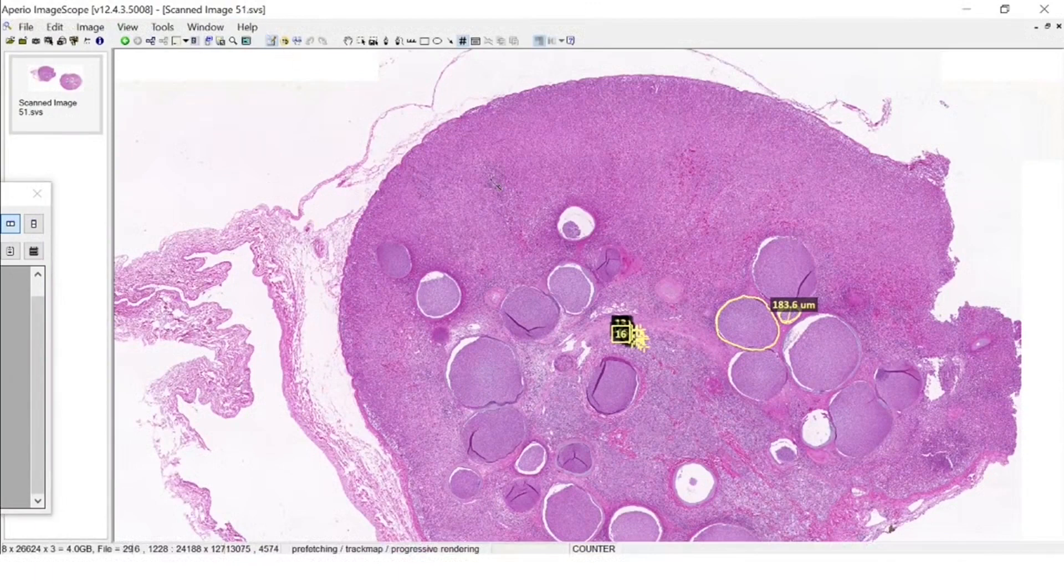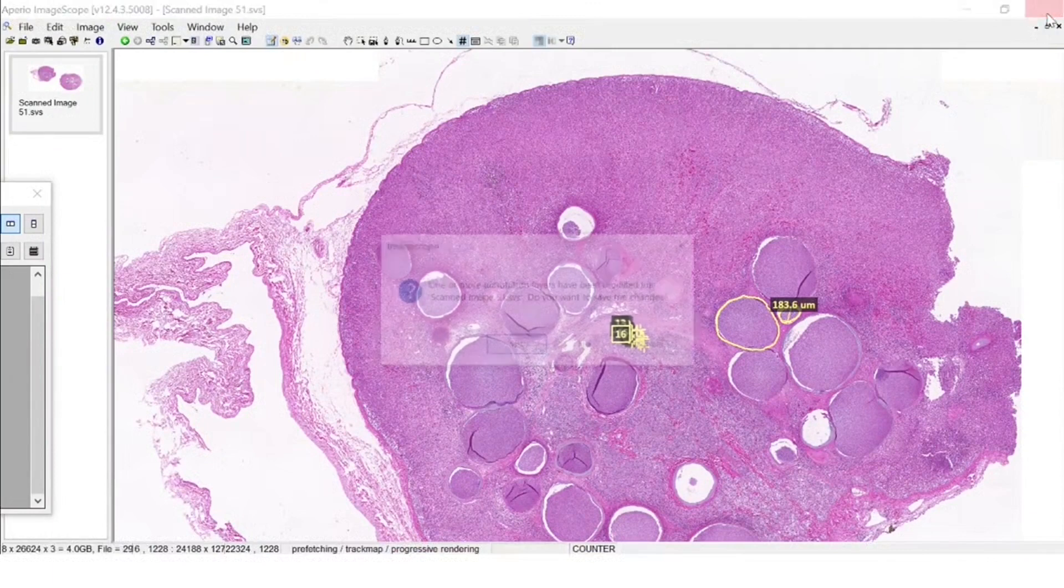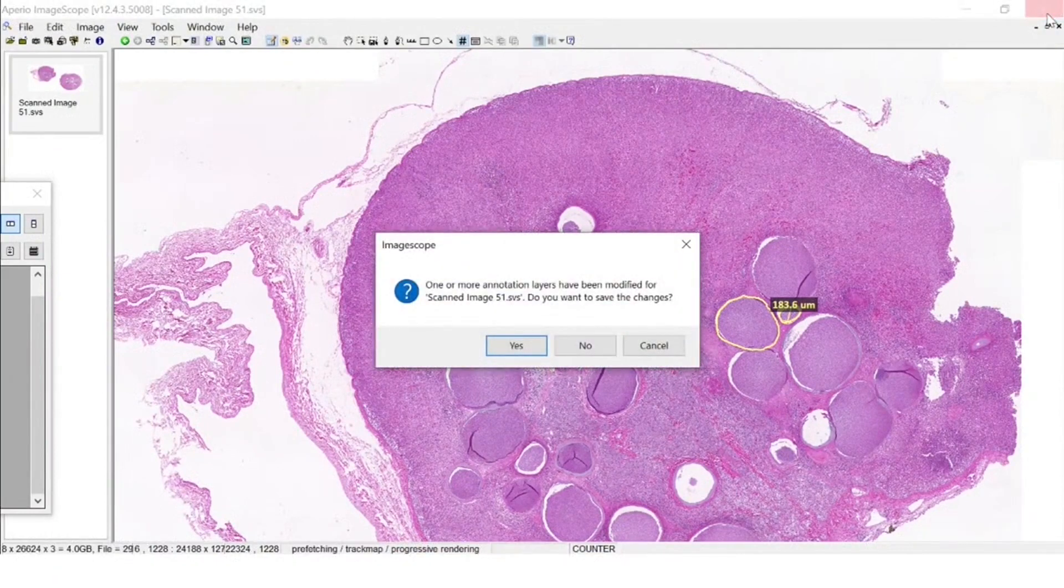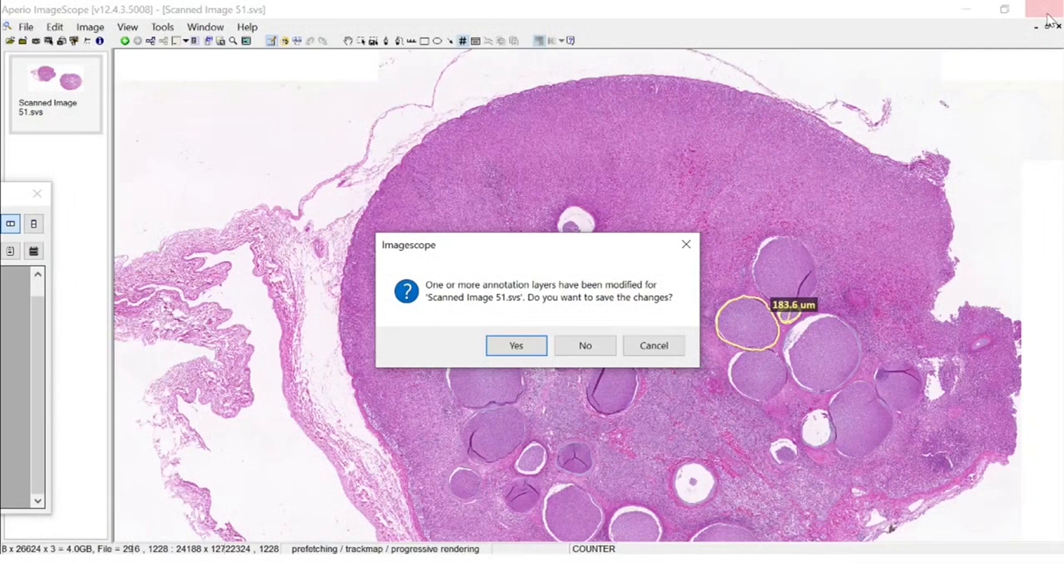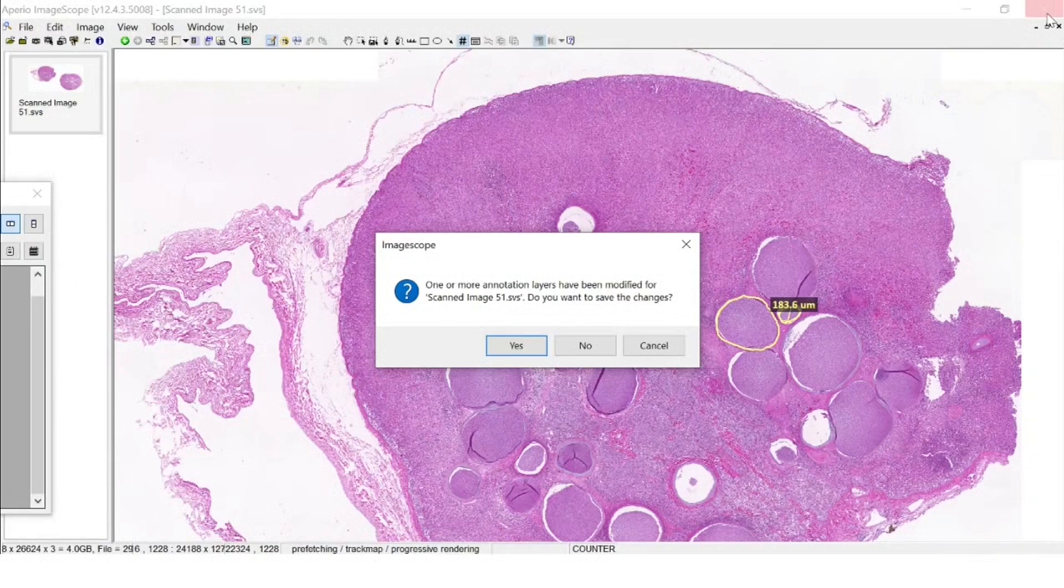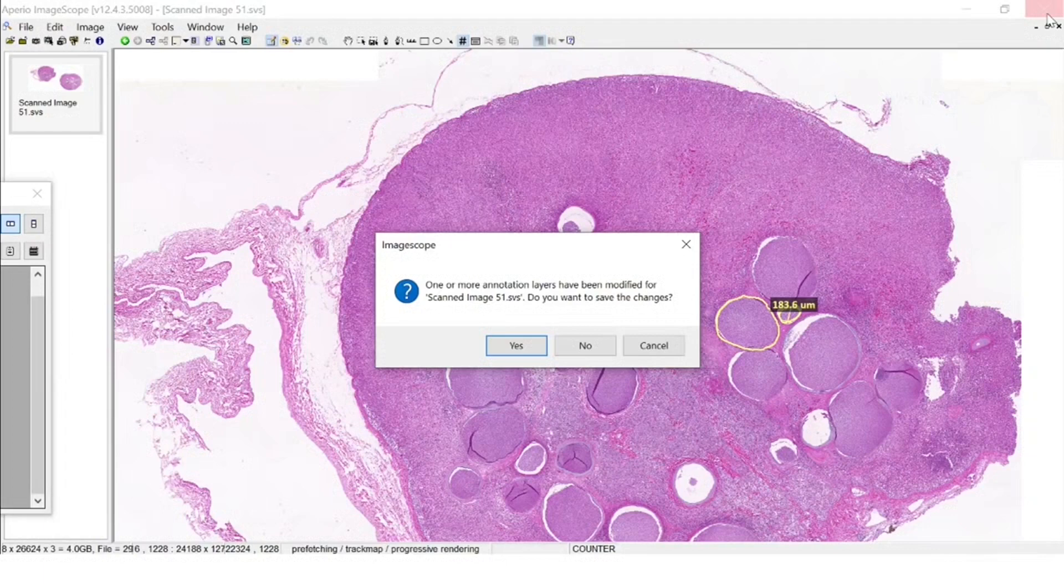It's going to ask you if you want to save the annotations, and you just say yes. The annotations are exported as an XML file and are stored together with the image. They are attached to the image. We do not modify the image, we just create a layer on top of this image.